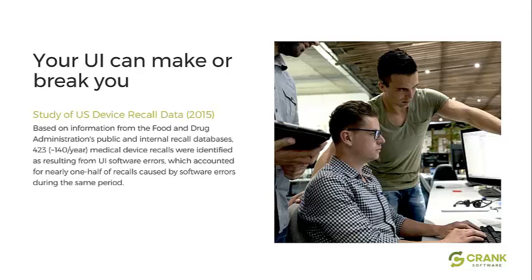But what this test said, and I put the link up for it, is that 900 software recalls in medical devices happened between 2012 and 2015, and 423 of them were related to the user interface. So that means that much of the user interface was causing issues. Those were tons of different issues, whether input issues, usability issues, or bad feedback, but a lot of that has to do with testing and how you get it to market.